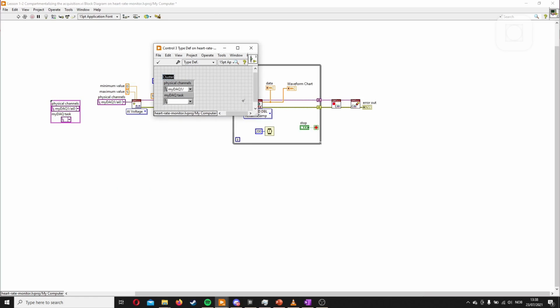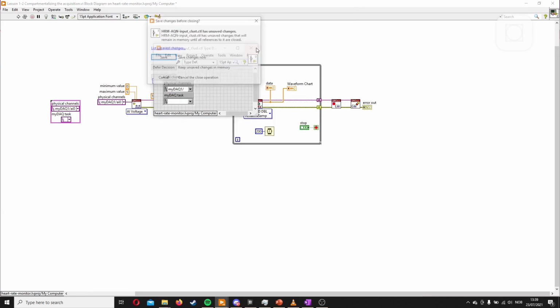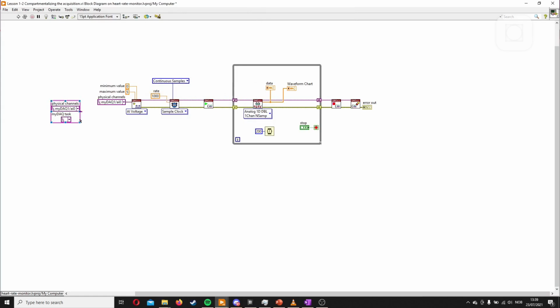We want to rename it to something more useful. So we can say the acquisition cluster. Not the best name, not the worst name. Save it. And we'll use some abbreviation. So it's heart rate monitor dash, it's part of the acquisition. This is just to tell me or you later what part it is. So we know it's part of the heart rate monitor, we know it's part of the acquisition, and now we want to call it the input cluster. And there you go, close this, save it, and we now have our clusters.